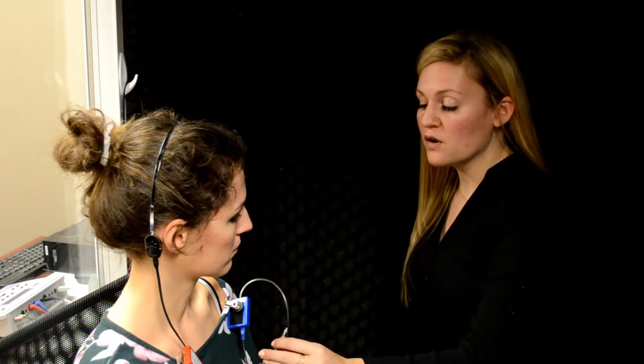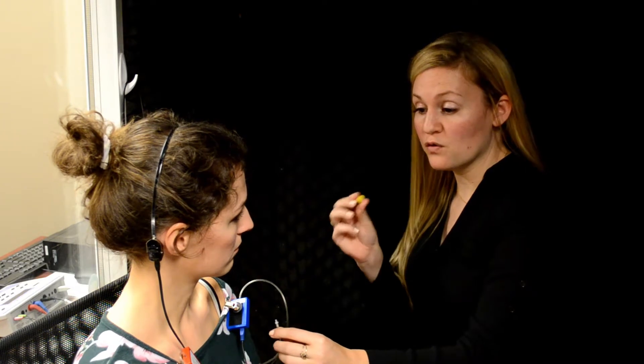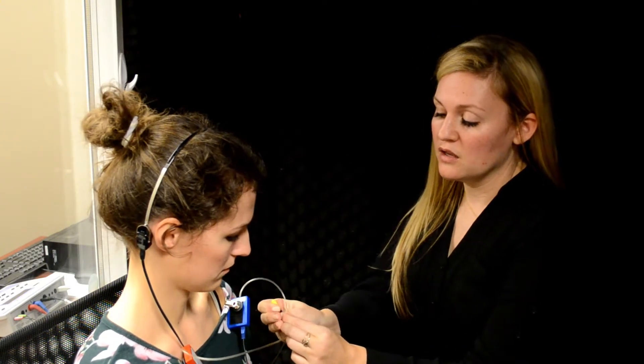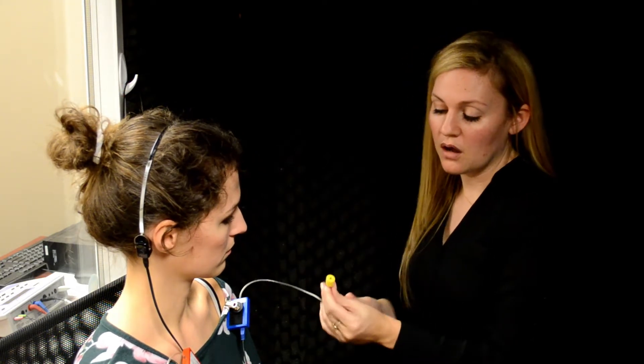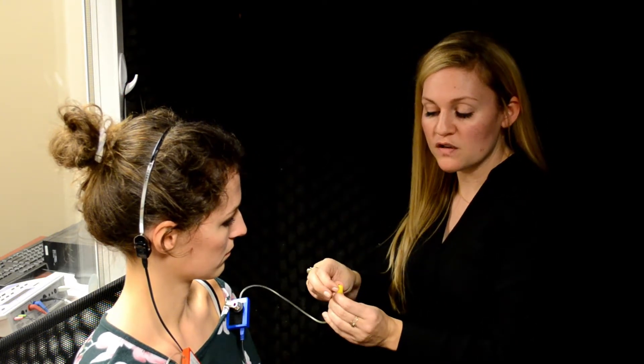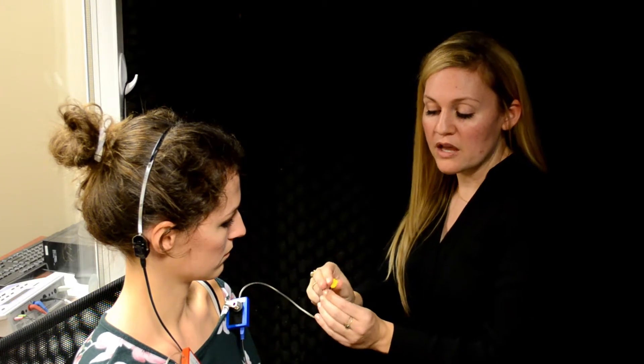The best way to do masking for bone conduction is with inserts — it's just the easiest method to use. If you do have insert headphones, first make sure that you have a new pair of foam inserts. When you're pressing down on the insert, you want to make sure that you press away from the hole so that the hole doesn't become occluded by the foam.